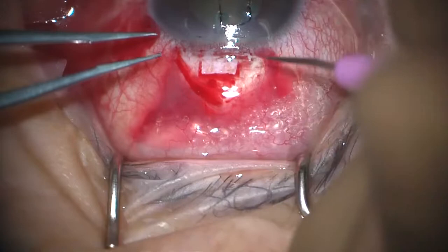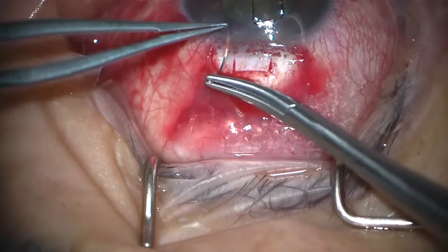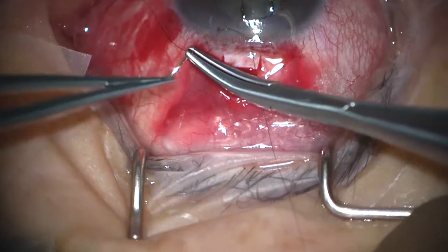Good, so I'm going to pre-place the releasable sutures. So reverse mount the needle. I'm just going to go nasal to the flap, and then up into the groove that I've already made. Pull that through, and you can see it can be a bit of a mess with all the sutures, so I'm going to move that to the side, and it just keeps it out of the way. Good, then forward mount the needle, in through the same groove, and up into the flap.